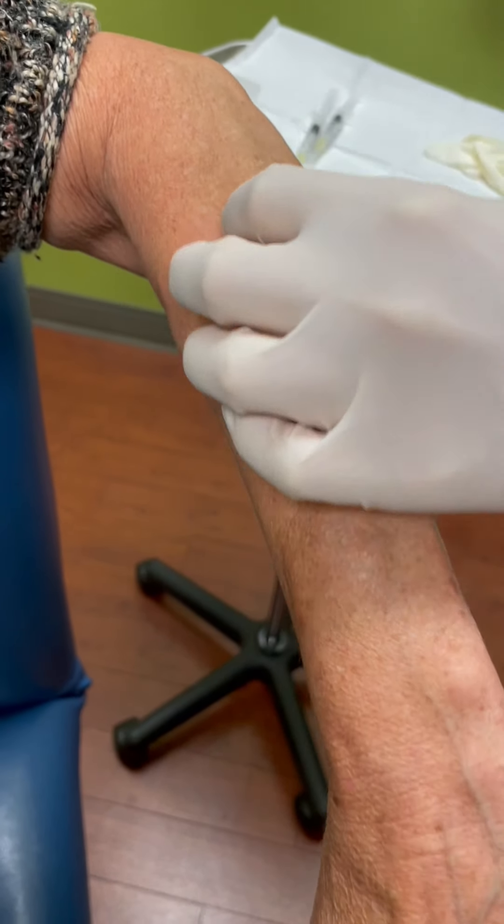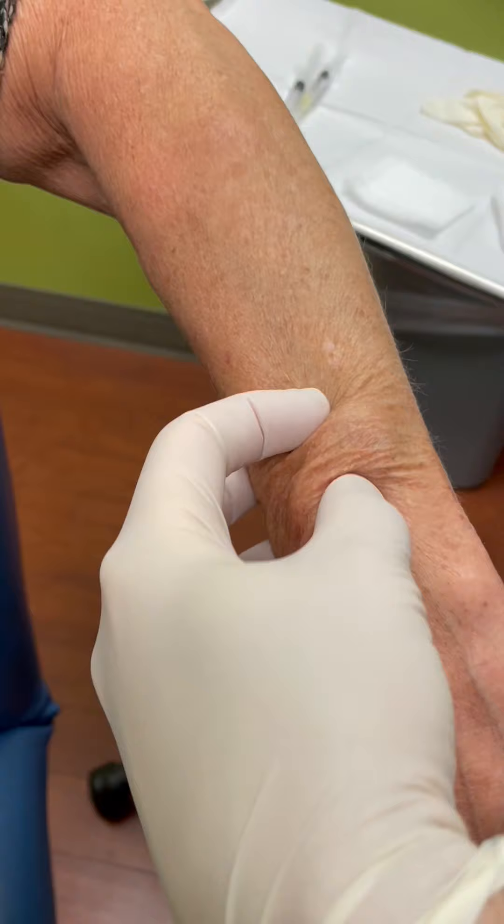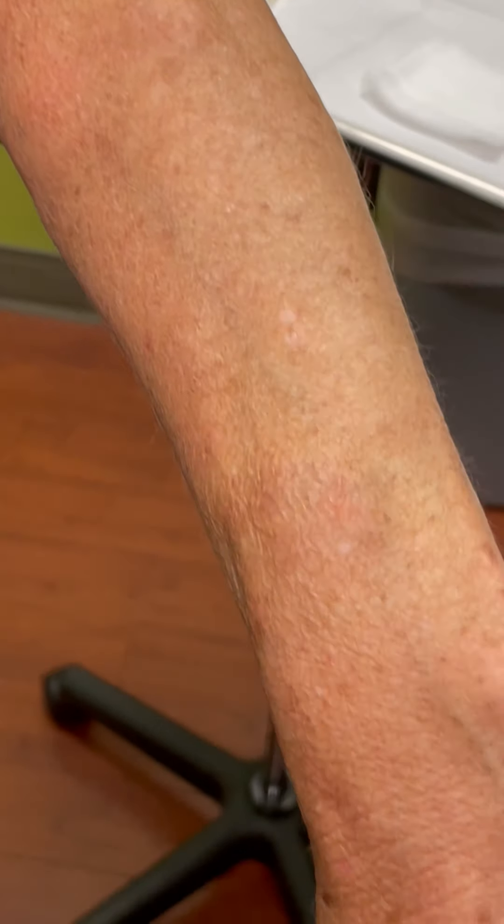Have you had any removed before? Nope. So what I'm going to do is just remove this one. I'm going to clean it, mark it, numb it, and then proceed.